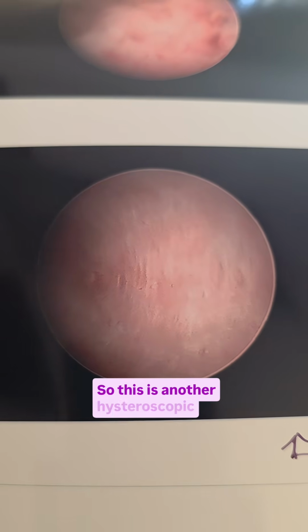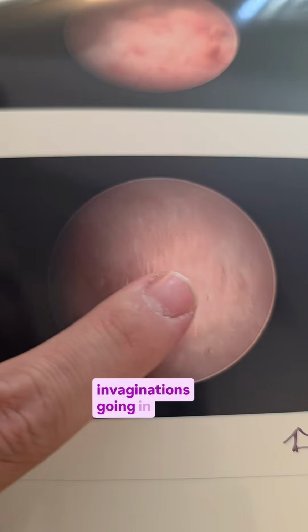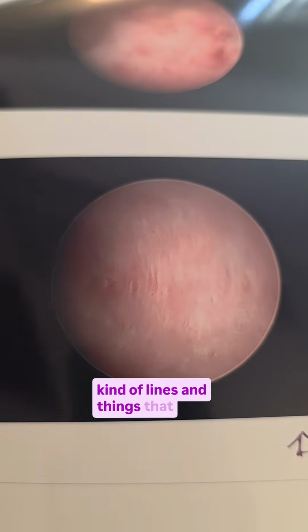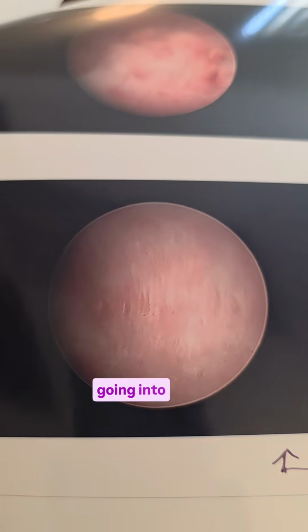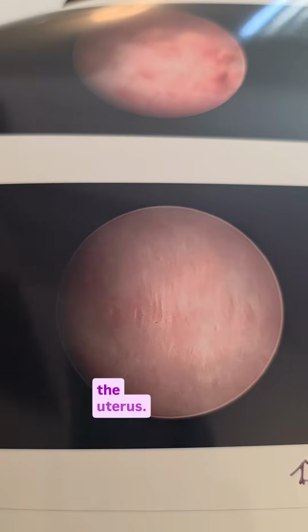So this is another hysteroscopic example of adenomyosis, where again, we see these invaginations going in, these kind of lines and things that look like indentations going into the top of the uterus. And again, that's demonstrative of the endometrium starting to push into the myometrial, or the muscle layer of the uterus.